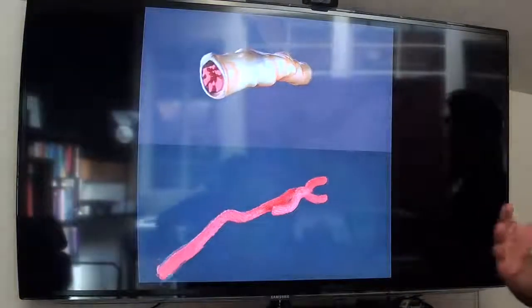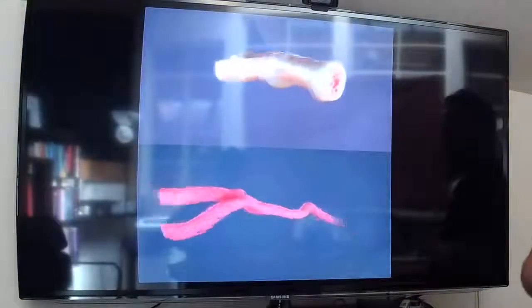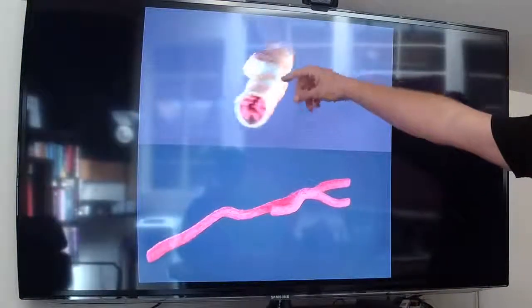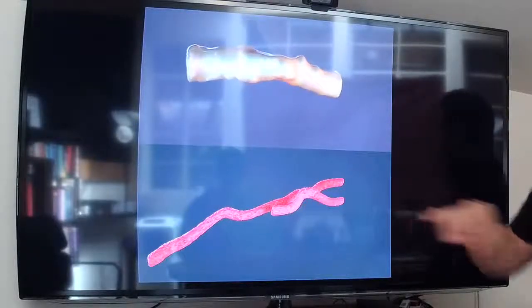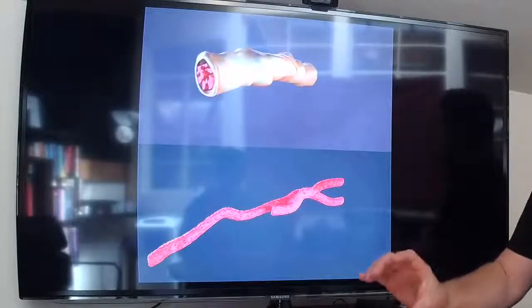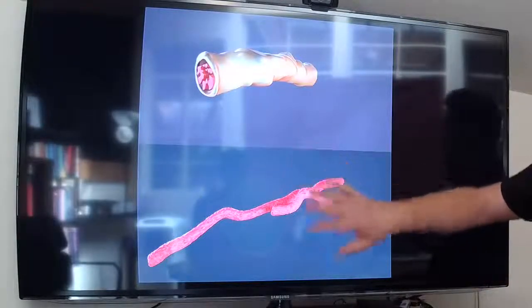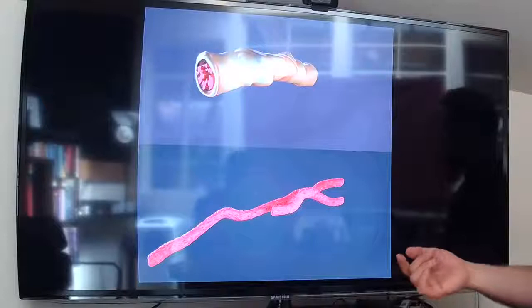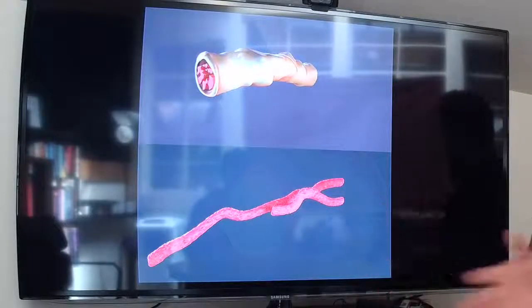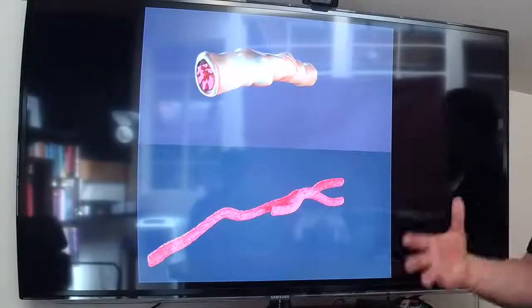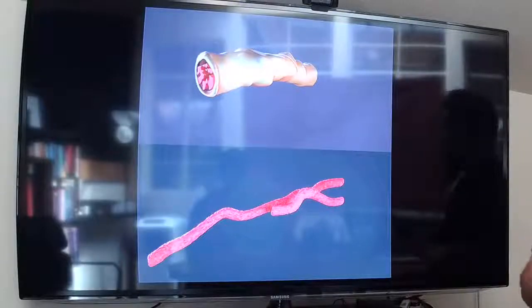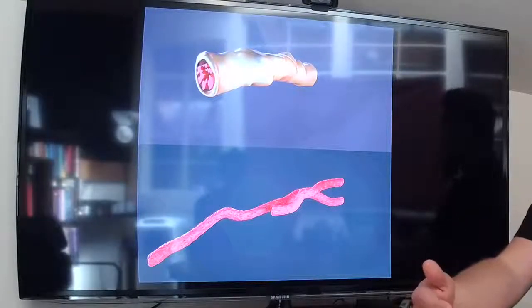And so from these 3D reconstructions, we can zoom in and do very high level, high detail descriptions. And so here's the peripheral nerve bundle and we can split it out and map out the individual fascicles. And once something is digitized and then reconstructed in 3D, we can design quantitative metrics around that to further describe and characterize the tissue, but doing it in a statistical fashion.